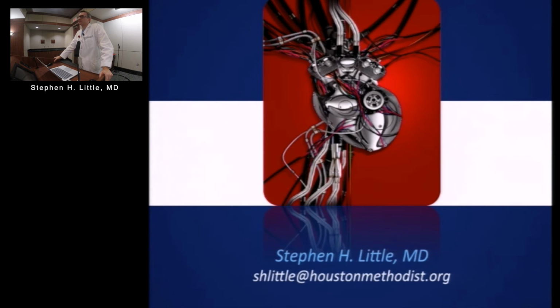Yeah, oftentimes, if it's still a central jet, because sometimes the first clip is almost non-functional. It's just to stabilize things and get you enough stability to get the big clip on. So really the first clip is a warm-up for the second clip. The second clip is the one you want to perform most of the MR reduction, and then you debate a third clip based on if it jumped to one side or the other, and also whatever the diastolic gradient is.